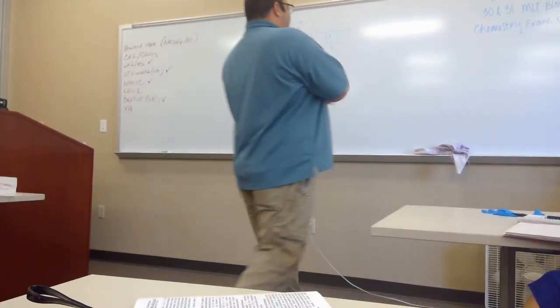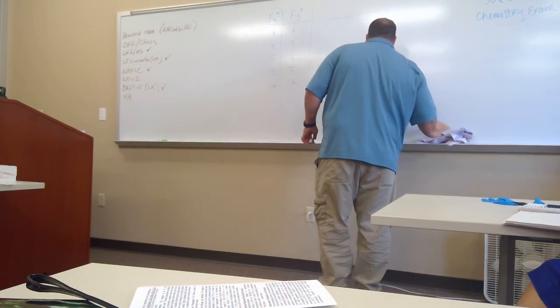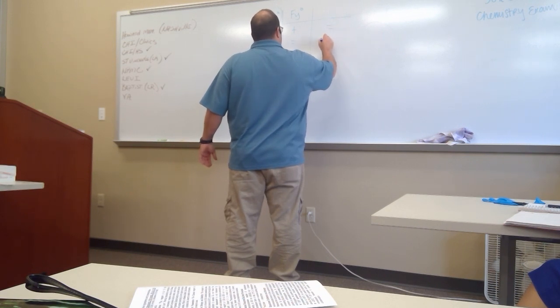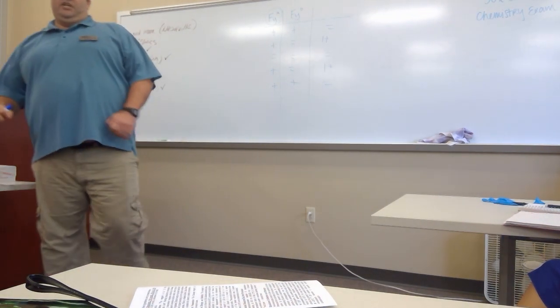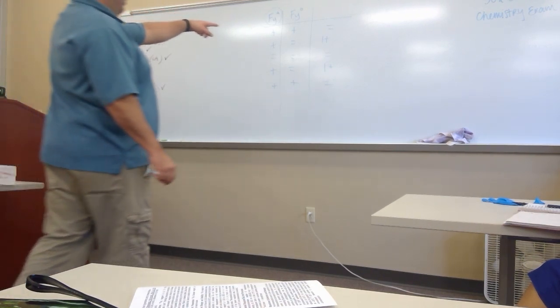This is usually not a problem until you start getting those really weak reactions, because what you might get is it may not react at all if it's heterozygous. Because even the homozygous one is pretty weak.